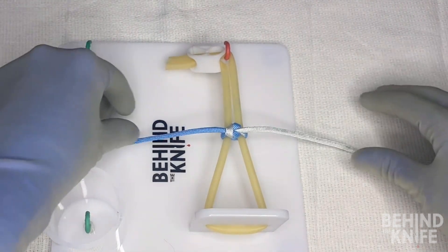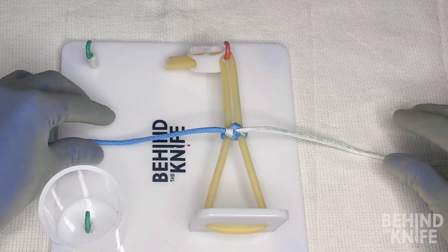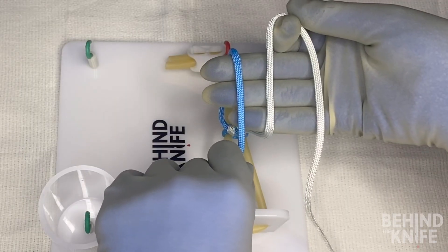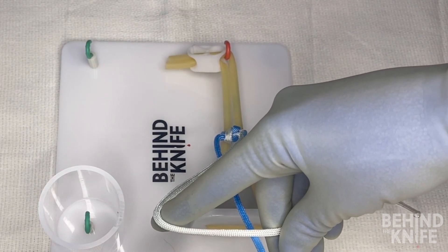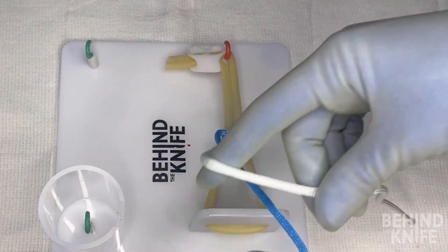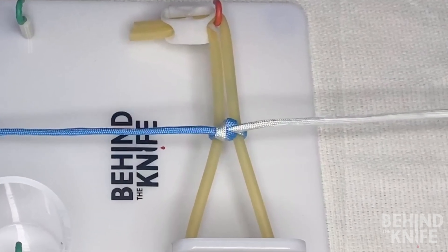Since we crossed our hands last time, we don't need to cross our hands this time. To continue, you would move back to laying your string across your right palm, then alternating back and forth between making your fours and laying the string across your palm for each knot, so that each knot lays square. And that is how you do a one-handed knot tie.